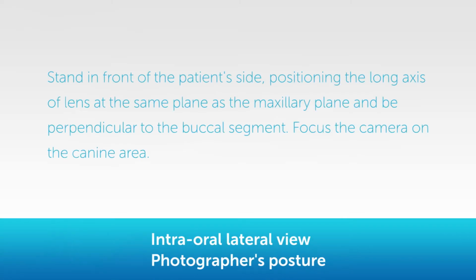Intra-oral lateral view. Photographer's posture. Stand in front of the patient's side, positioning the long axis of lens at the same plane as the maxillary plane and be perpendicular to the buccal segment. Focus the camera on the canine area.